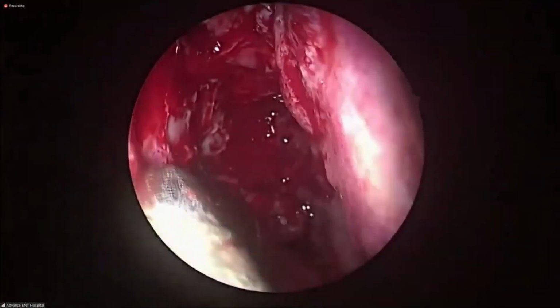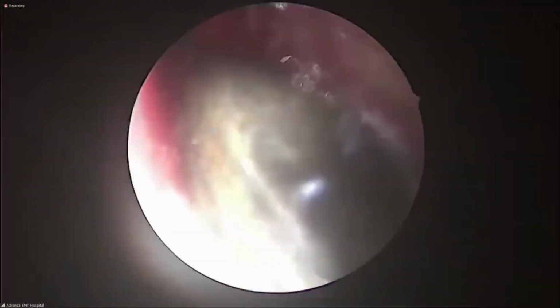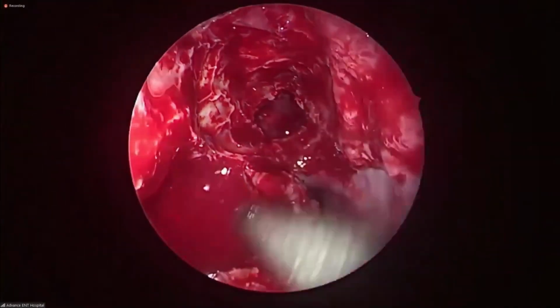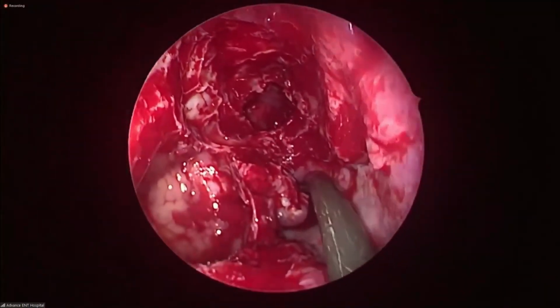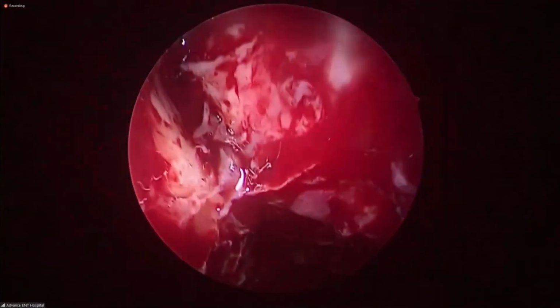And the bleeding has stopped, sir. See now, the picture is good. Yes, sir. We'll just pack this side and this is full house.